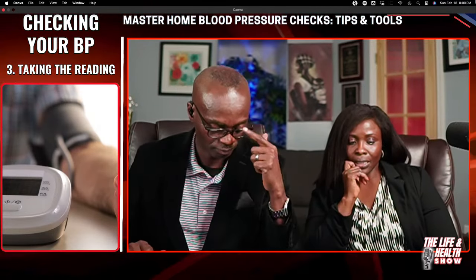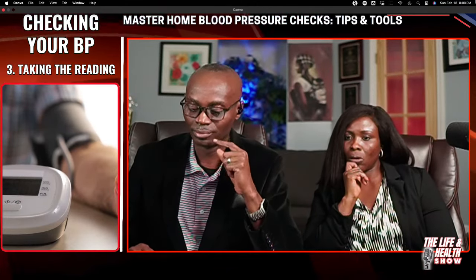That you have to remain silent and still during the measurement. You don't want to talk or get distracted when you're taking the reading. My goodness, that is another big one that people miss. Hey, John, what are you doing? Don't you see I'm taking my blood pressure? No, you can't do that. Come on, man.